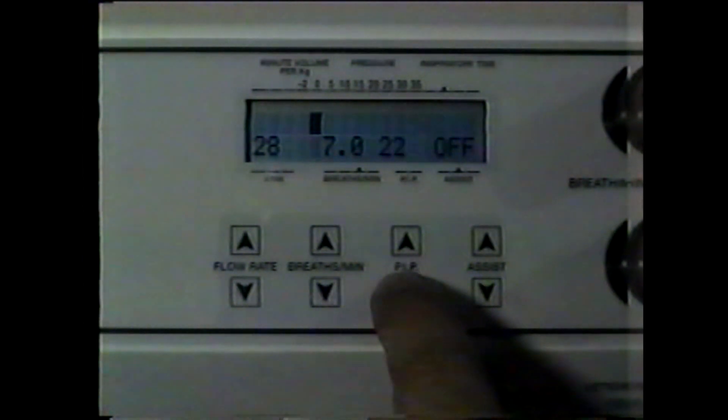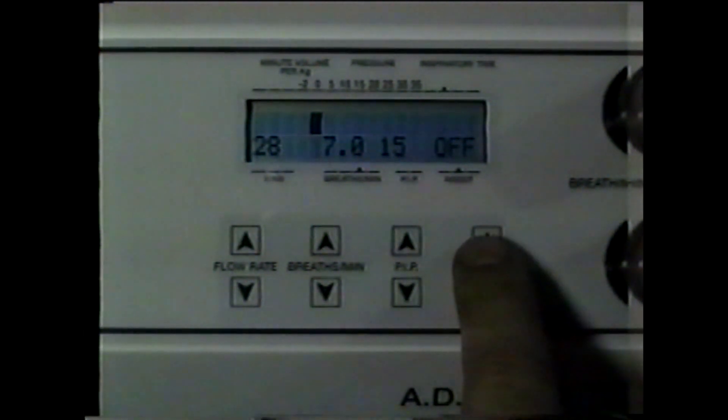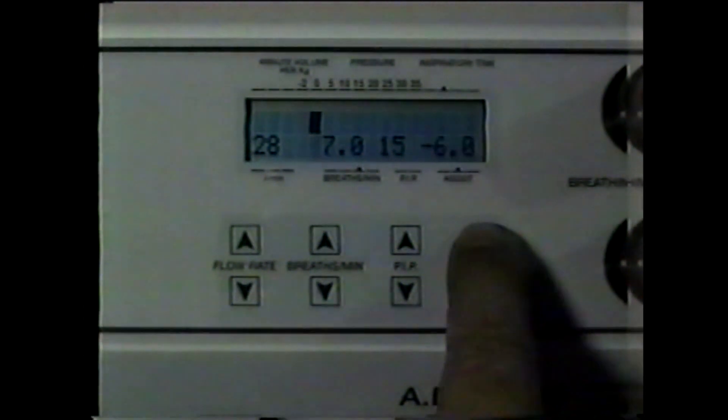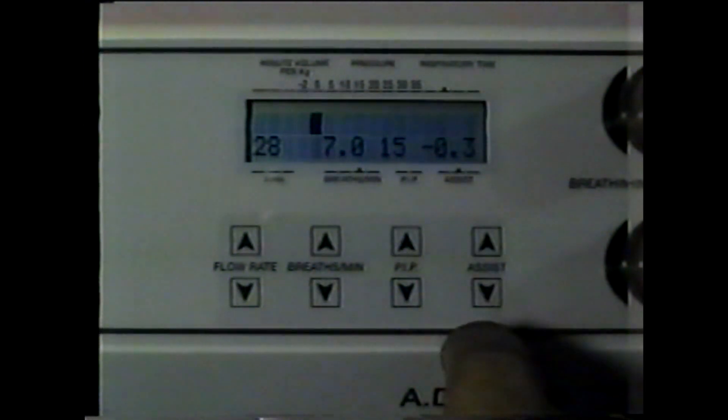When the assist is off, the ADS completely controls ventilation. When the assist is on, the patient may initiate a breath. The assist may be set from negative 0.3, which is the most sensitive setting, to negative 6.0 centimeters of water, which requires a greater effort on the part of the patient.